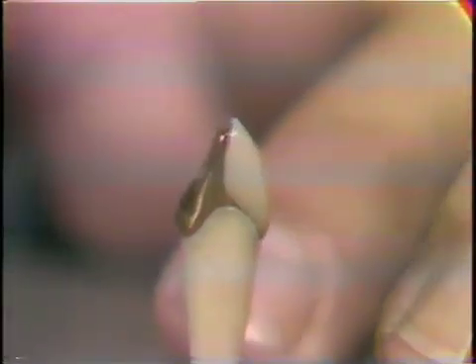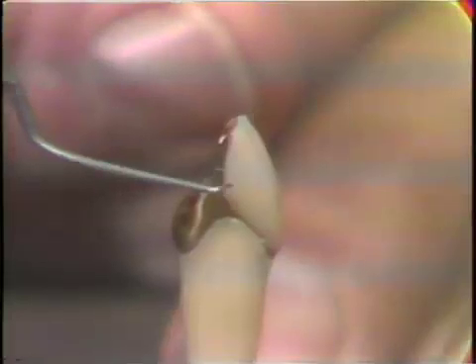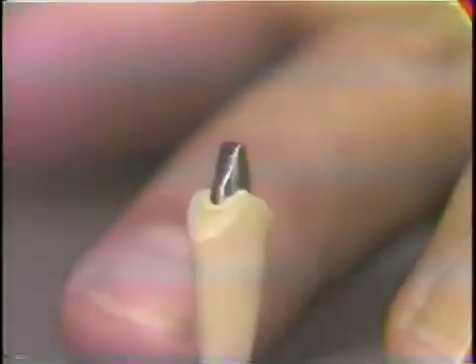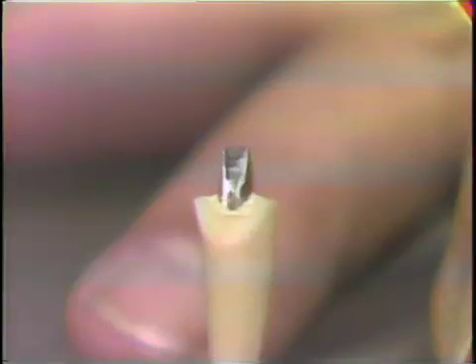This crown was not designed as part of a bridge, but just as a single restoration. In that case, you don't need to bring the gold so far forward. You can see there, I think, that if you wanted to place a connector in this situation here, you would need to bring that gold a little further to the labial in order to get a soldered joint or a cast connector in that situation. This then is a veneer crown on a core post on a non-vital tooth. Very similar to the regular veneer crown preparation, except for the differences which we have mentioned.